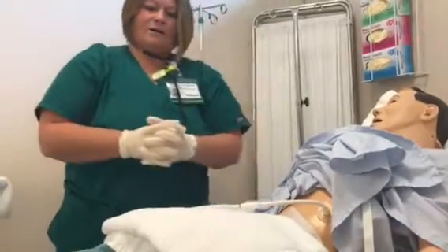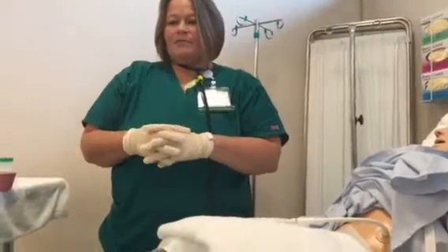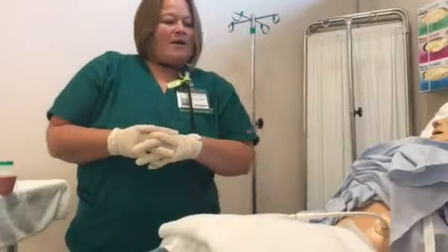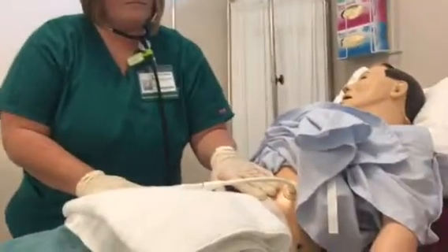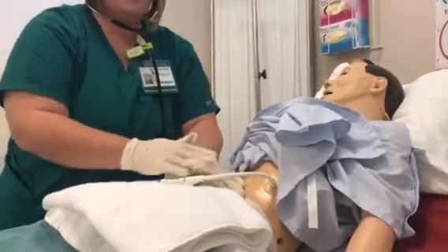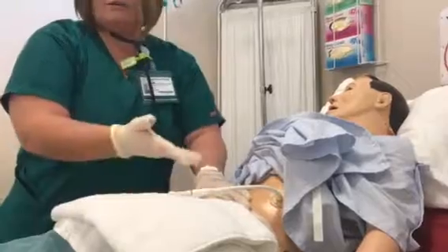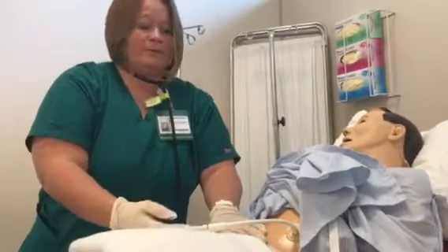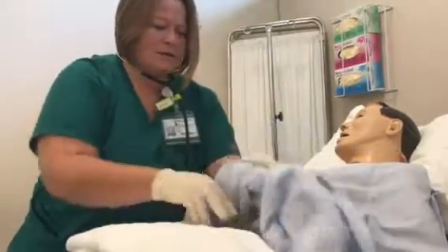At this time, I could go ahead and wash my syringe, my bag, and my tubing in warm water. And you want to make sure that you're getting a new administration kit every 24 hours. I would then take a look at the site. I want to wash with warm water. I want to rinse it. I want to pat it dry. I can leave it open to air unless there's a specific order that states that I maybe need to apply a drainage sponge. Everything is good.